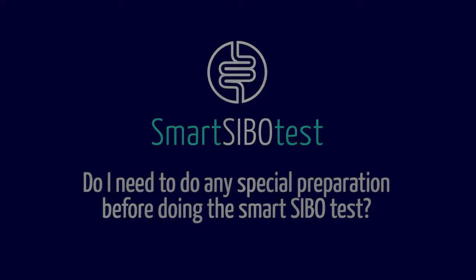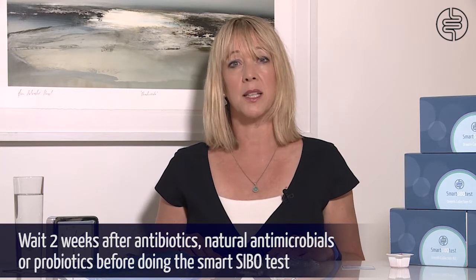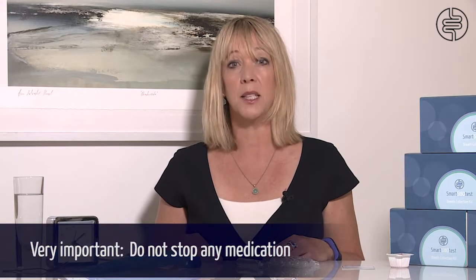The Smart SIBO test cannot be done for two weeks after colonoscopy, two weeks after taking antibiotics, for natural antimicrobials such as garlic and oregano, or if you currently have diarrhoea. You need to stop taking probiotics, digestive enzymes, stomach acid and laxatives before you do the test, but please do not stop any medication.